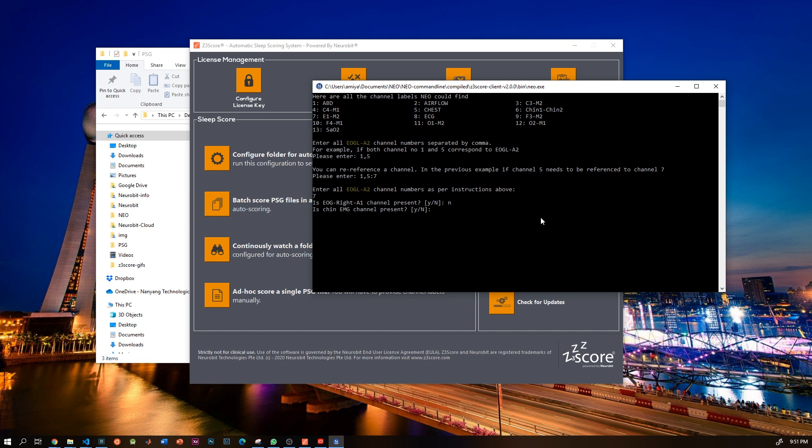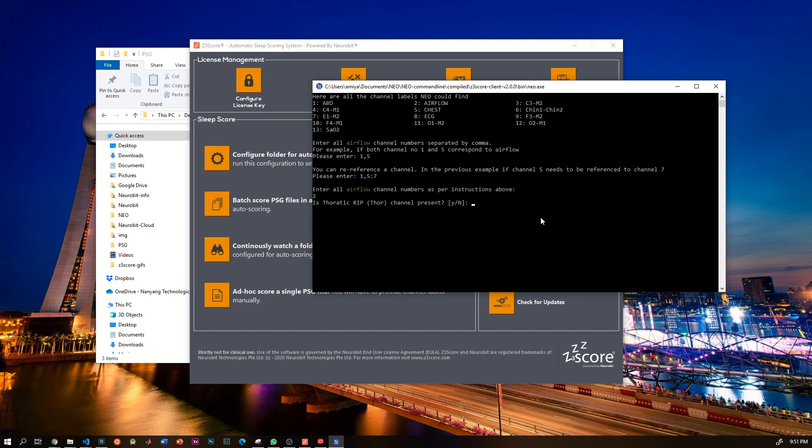Now you do this for all the EEG, EMG, ECG, respiration, and SpO2 channels. It will probably take you one to two minutes to do this. Once you are done with the channels, it will then ask you whether you want to do spindle detection.